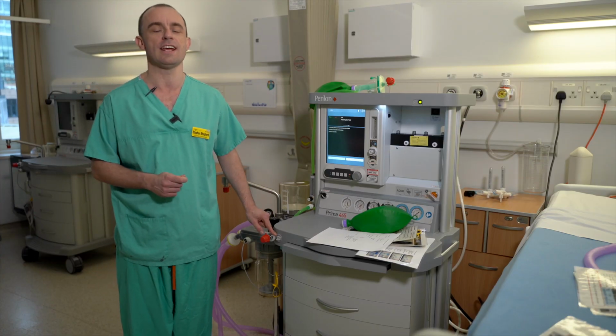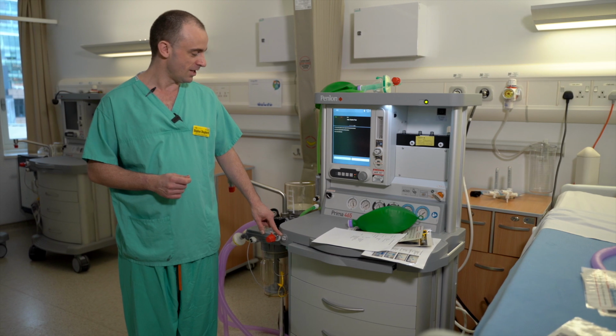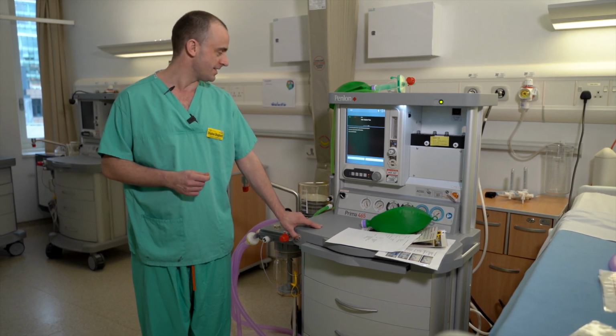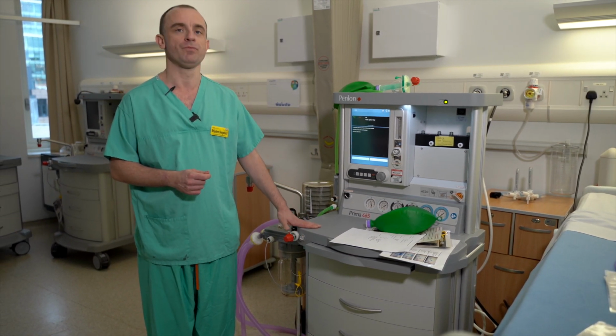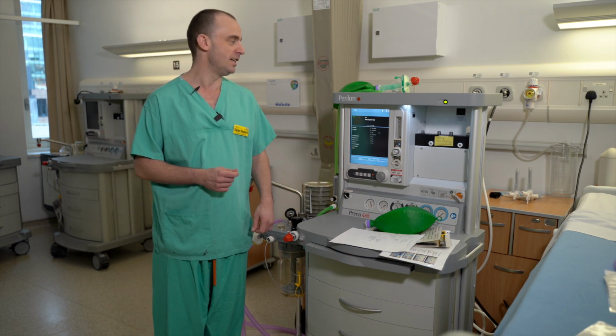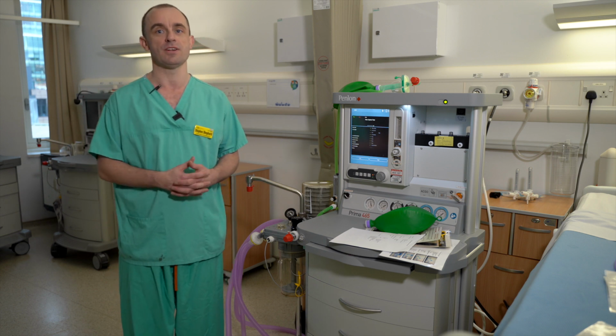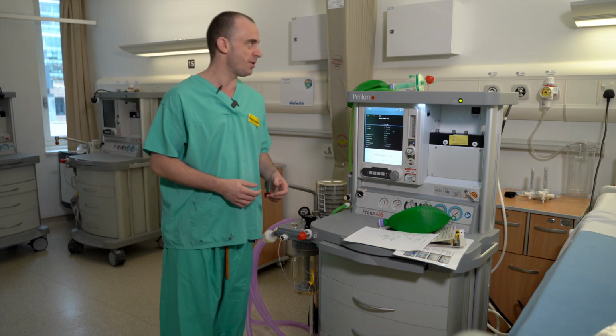It's not to be used at any point when the ventilator is connected to a patient. But this essentially lets you fill the ventilator to do the check. You'll see here that the ventilator is filled, and the next thing to do is press start. And now we'll get a test of both the ventilator, but also a test of the circuit to make sure that there's no leak.